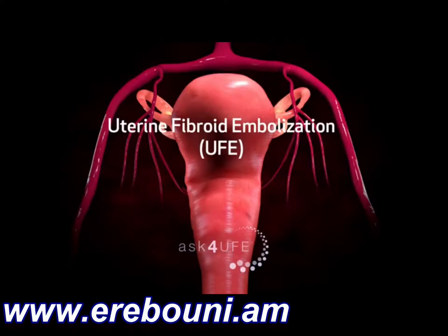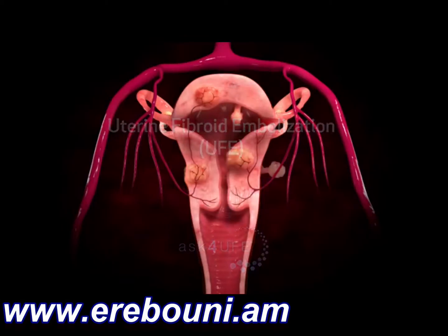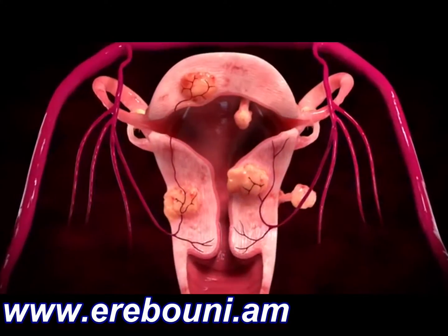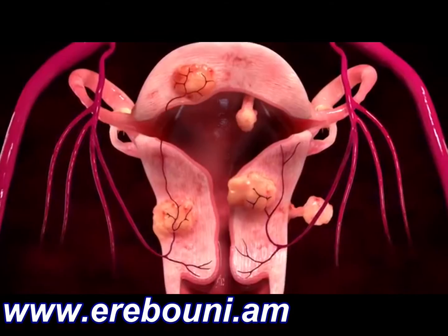This video has been produced to familiarize you with the Uterine Fibroid Embolization procedure, UFE. UFE is a safe, effective treatment for fibroids that has been performed for nearly 20 years. It is one of several treatments that may be used to treat fibroids in the uterus.